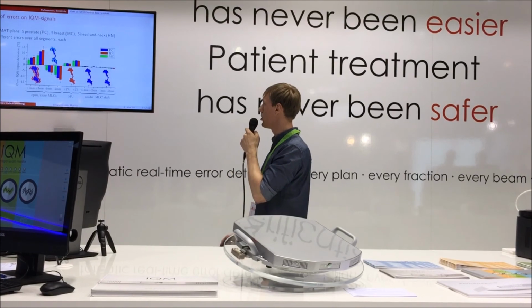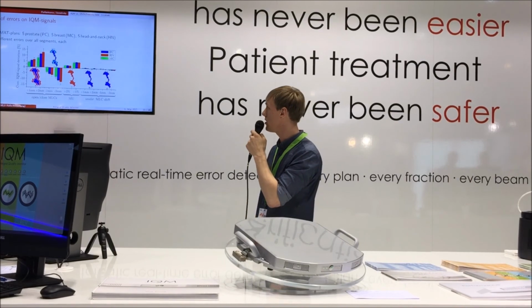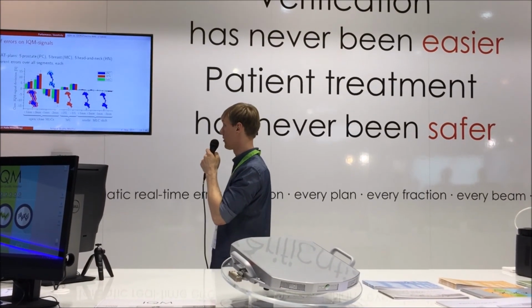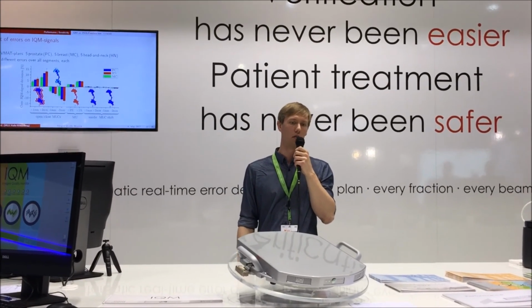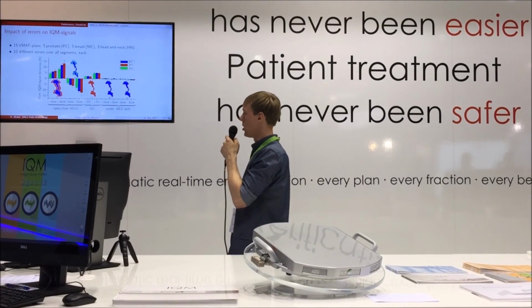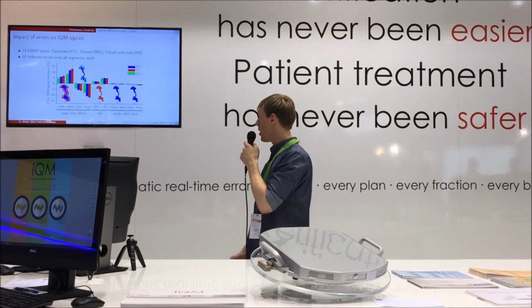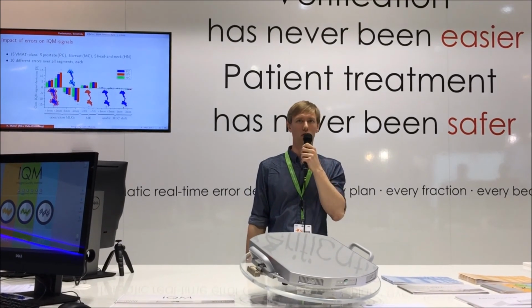And the bar chart down there shows us the cumulative IQM signal deviations, the averages of those signal deviations between the measured error plan and the measured original plan. And herewith we can state that opening and closing the MLCs by 2 or 1 millimeter results in an increase or decrease of the IQM signal by 10 or 5% respectively. And for the dosimetric errors, we see a linear correlation between the enhancements of monitor units and the IQM signal deviations. But all plans involving a unidirectional shift cannot really be distinguished from the original plans.